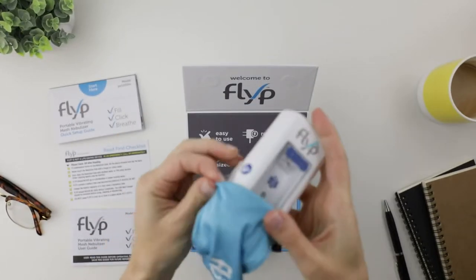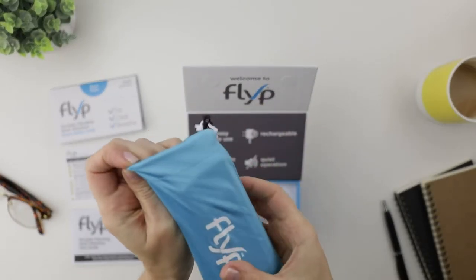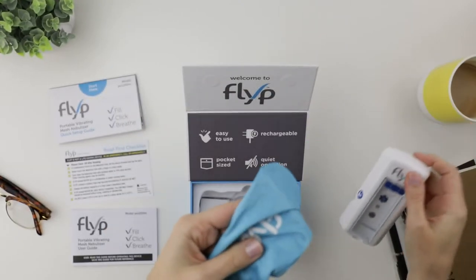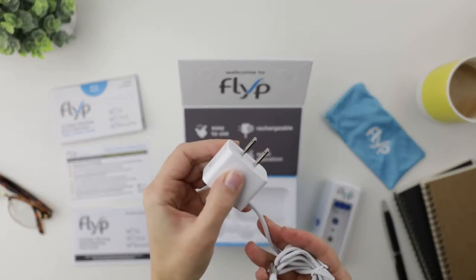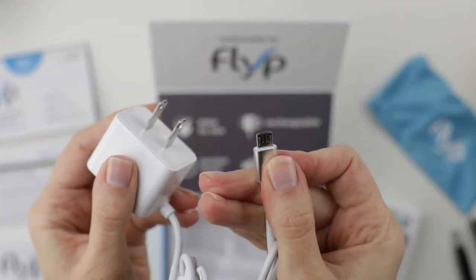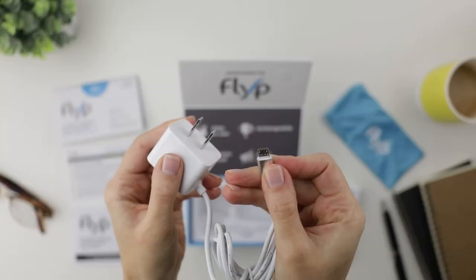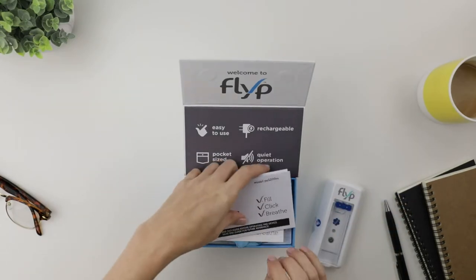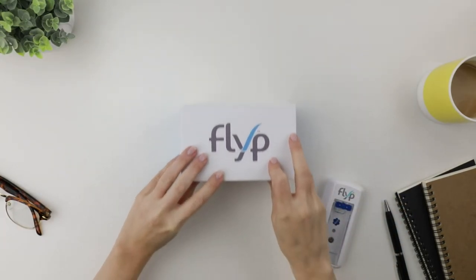Now let's just flip Flip in — and this keeps it nice and secure. USB charger. Glad I don't have to deal with batteries anymore that just add to landfills. Plus, I get to save money. What is not to love about that? Guys, I hope my unboxing video was helpful. But hey, you really need to check this Flip out.